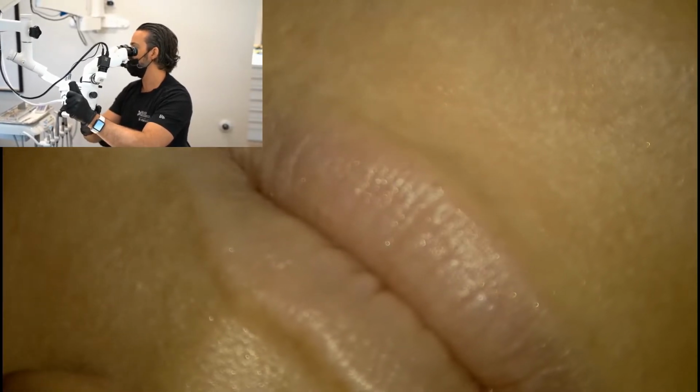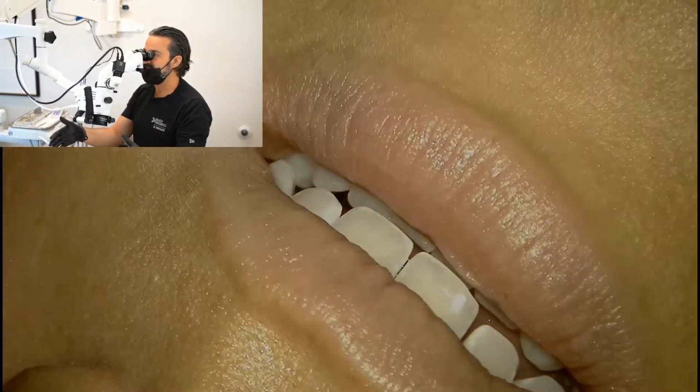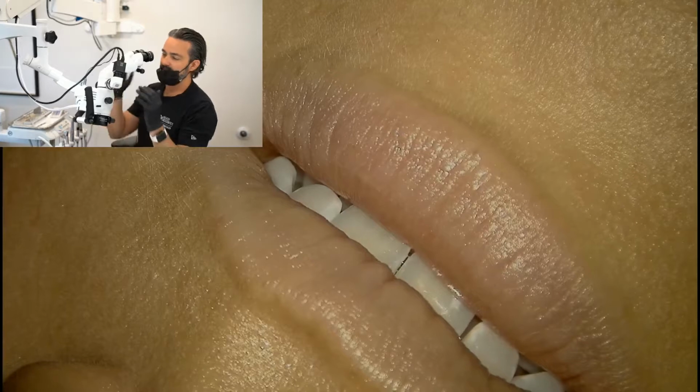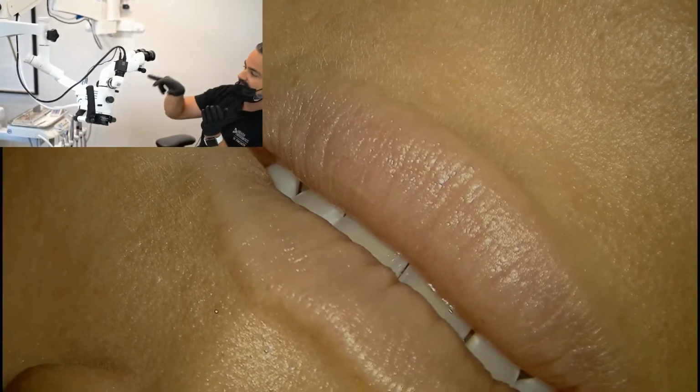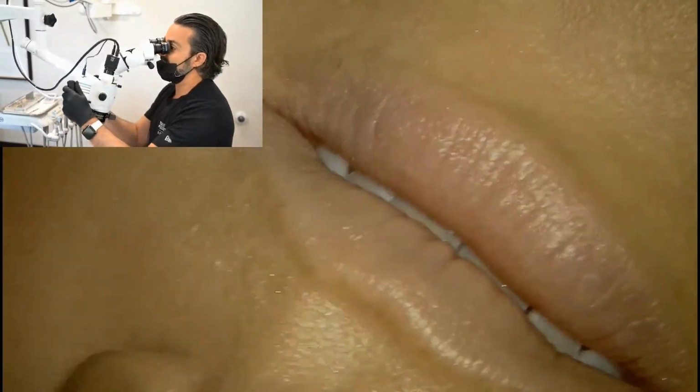And so that was something that might be really helpful for guys who think about where they sit and the ergonomics of their practice. If they're coming off axis like this, then this is something that is very useful with these corrections, as you can see the different articulation points. And on the lower, it's roughly direct vision.